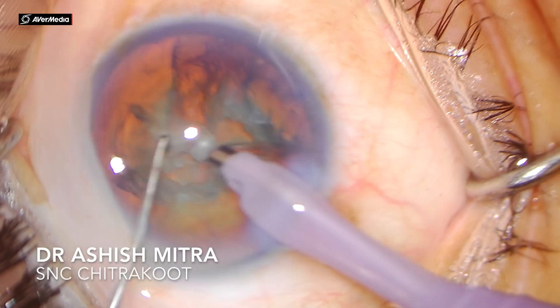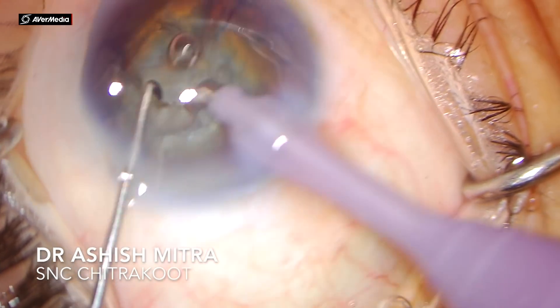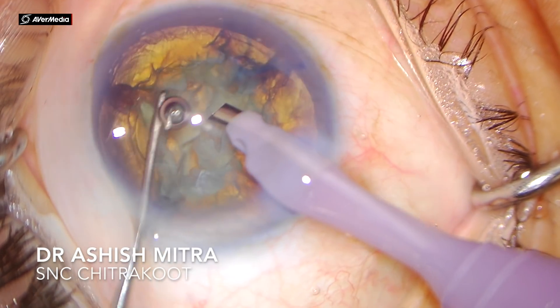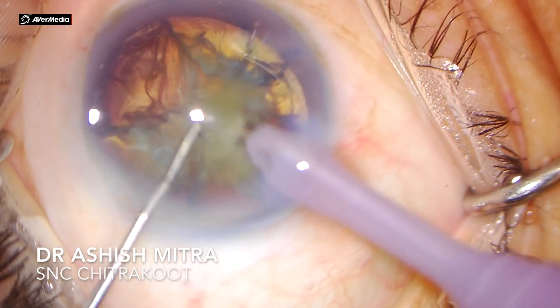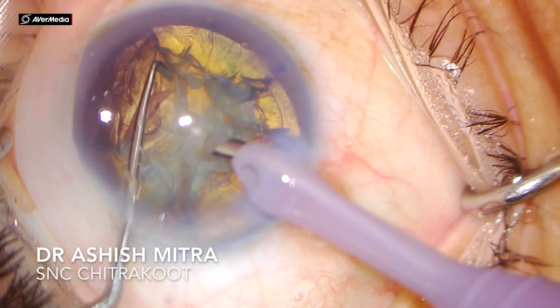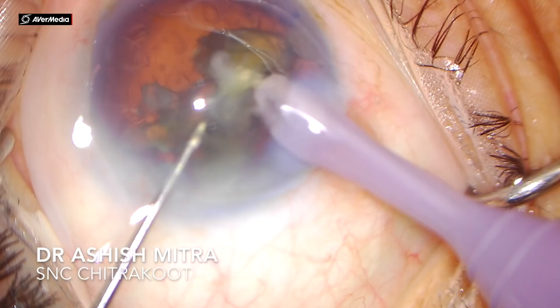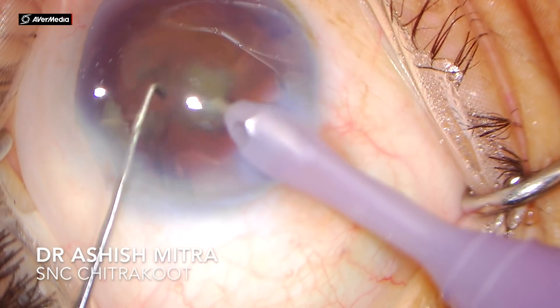After holding, you make a crack — this is what is different from conventional stop and chop. I am holding the pieces and breaking into two. You have to go to foot position 3 in feco 2, come to foot position 2 to maintain that hold, then crack. The trench part is in feco 1; the holding part is in feco 2. Feco 2 settings: power around 50 to 60, aspiration around 36, vacuum between 300 to 400 — I usually prefer 400.